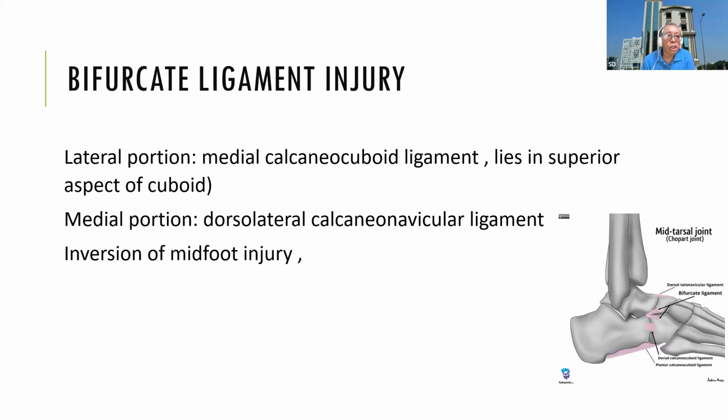And tear or sprain of the bifurcate ligament is common during inversion injury of the ankle.